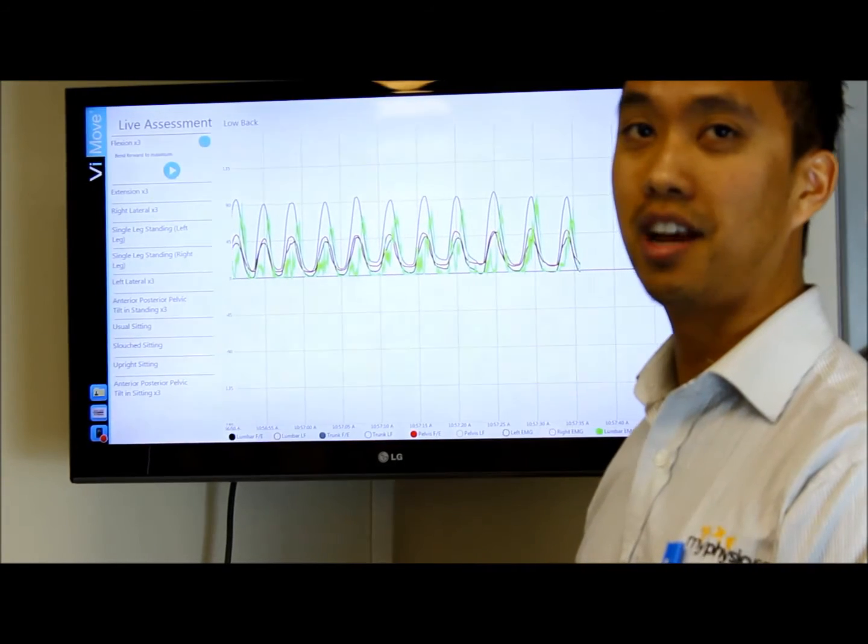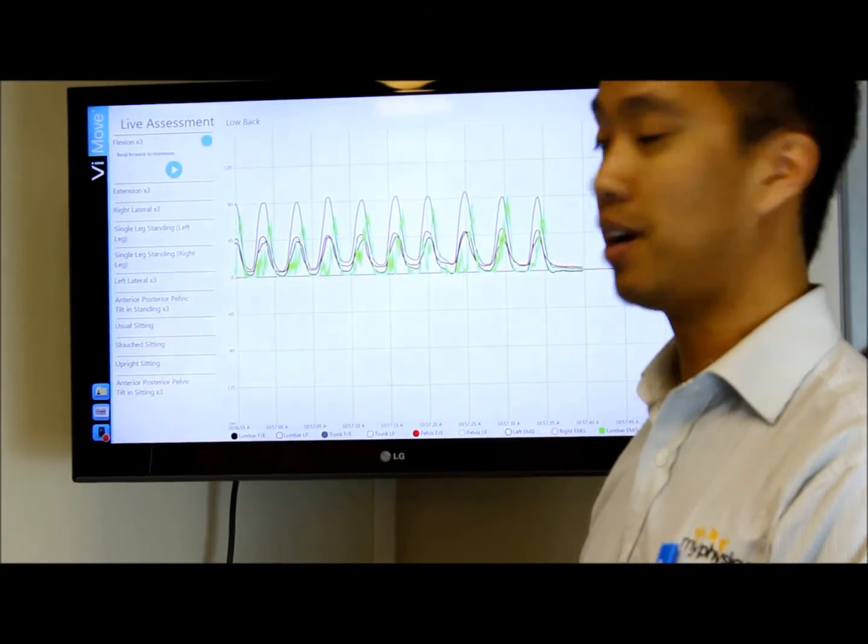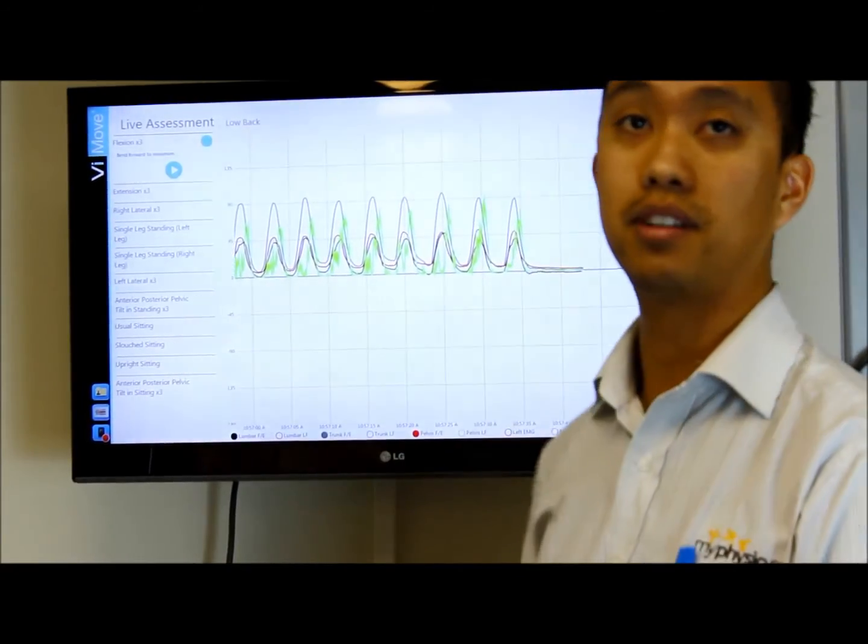With our patient here, she doesn't have low back pain, but for a person that does have low back pain, a lot of these values would be significantly different.